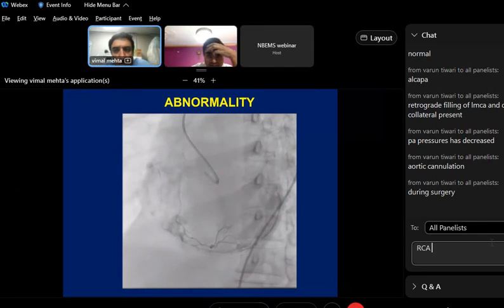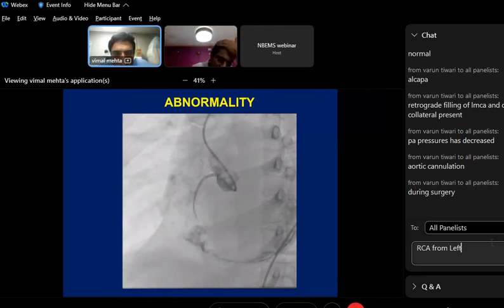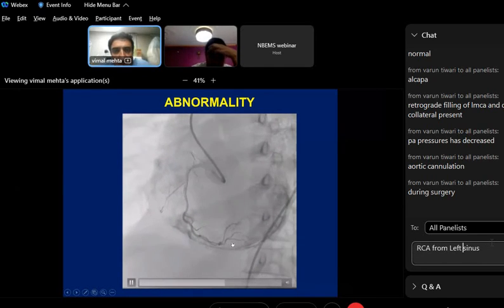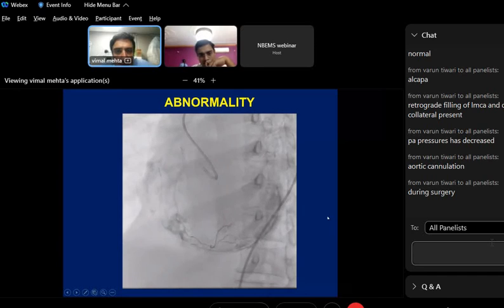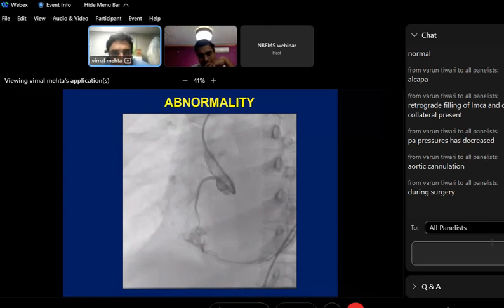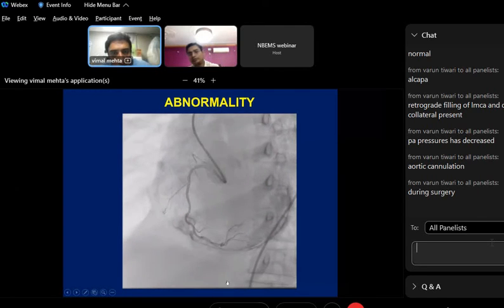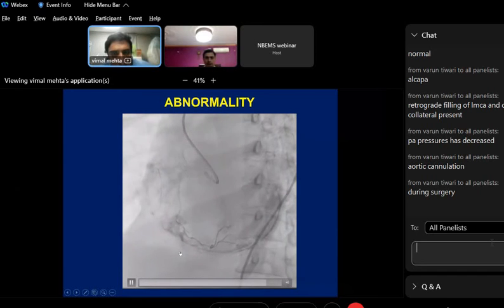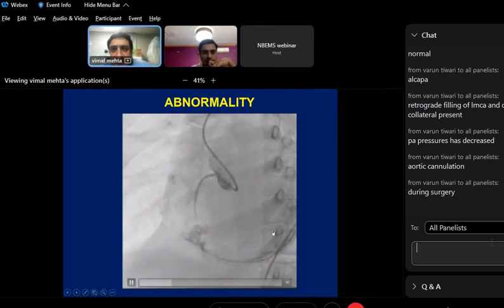So this was a fellow who was complaining of a lot of dyspnea, a lot of chest pain, a lot of symptoms. Pericardial calcification, very good. So we see a lot of pericardial calcification, and you call it that not because of dye, because many times if there is extravasation, some sort of leak from the coronary, you will again see this kind of thing. So this can be seen even before injection is done. So this is pericardial calcification. So this is a case of constrictive pericarditis.